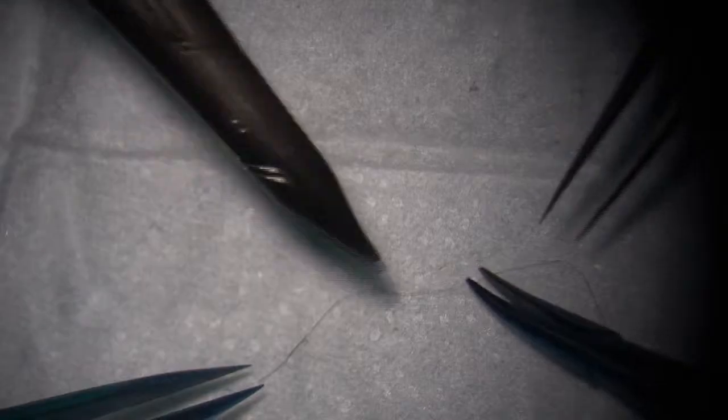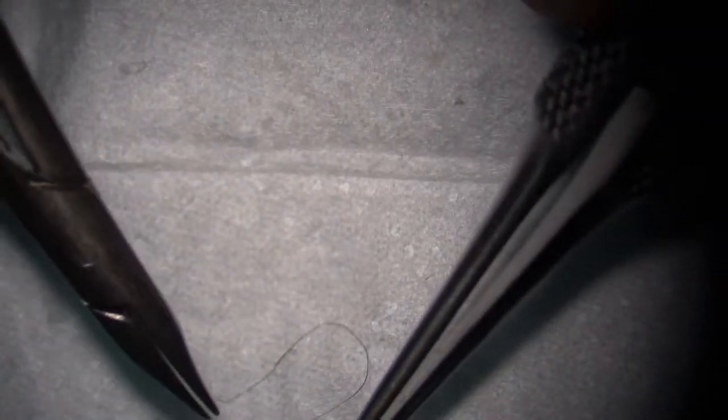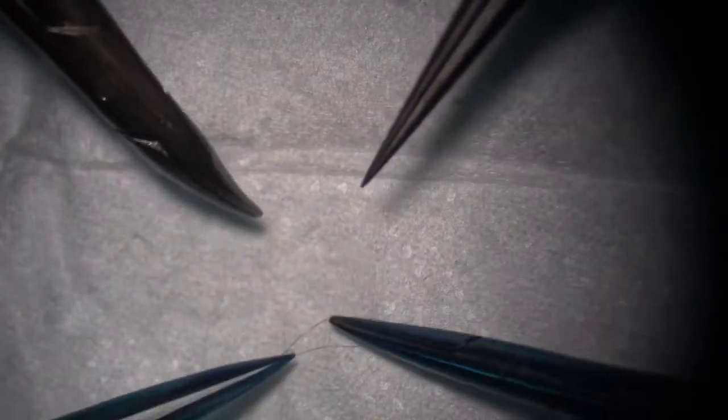So I have my first surgeon's knot down. I locked it. Yeah, bring it back in front of you. Don't just let go. Bring it in front before turning. Okay. Try to make it closer. Yeah, for the second knot, just 1 loop is good. Only the first one is a surgeon's knot.